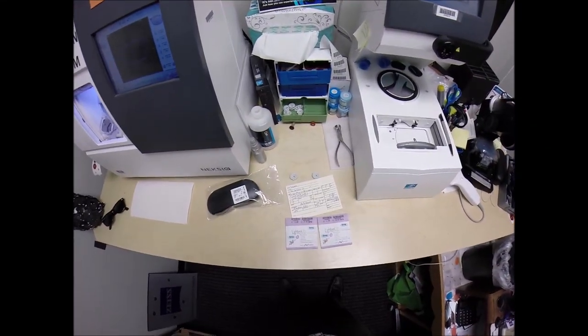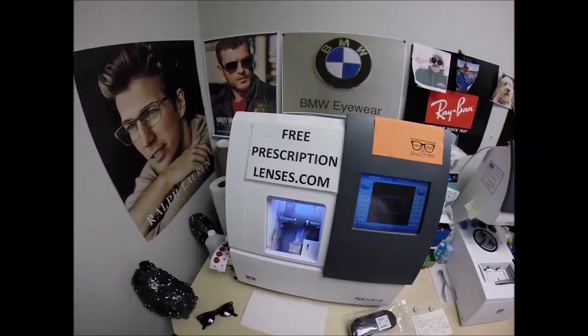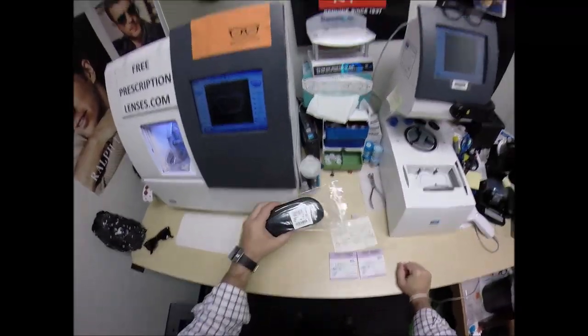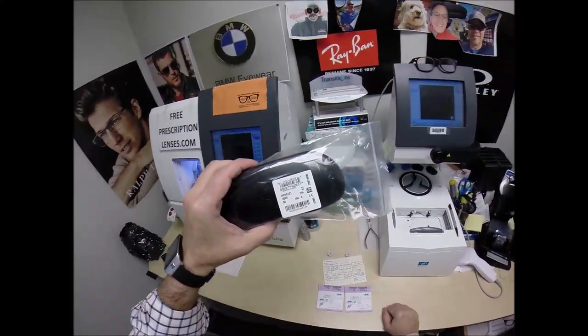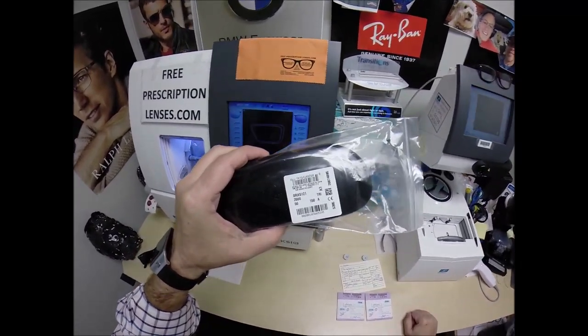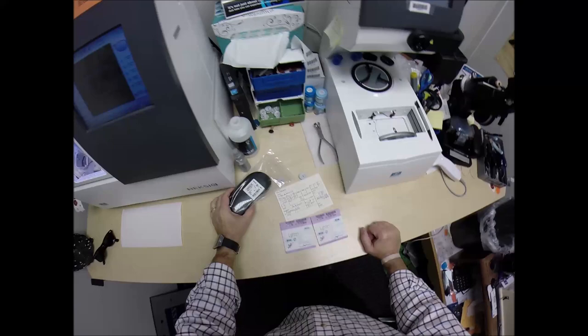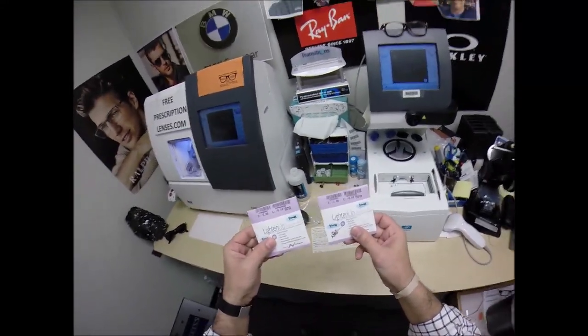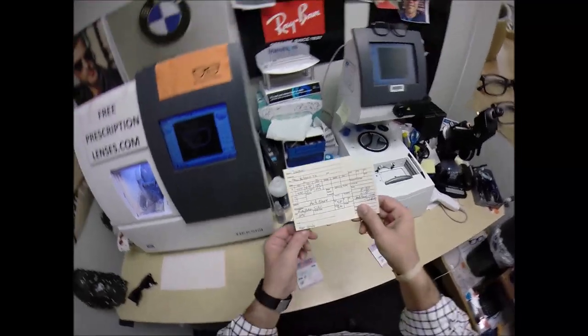Davani in San Antonio, Texas — see more better here with FreePrescriptionLenses.com. Tonight I'm going to cut the Ray-Ban 5121, the ophthalmic version of the original Wayfarer, color 2000, the classic shiny black in the 50 eye size, with prescription lenses with anti-glare.